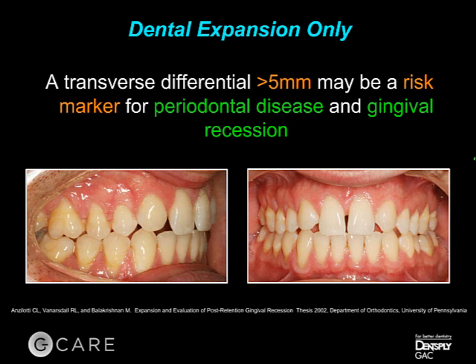When the upper jaw is too narrow and we try to get normal dental relationships on a skeletal base that is not normal, we could leave the teeth at greater risk for periodontal problems in the future, such as this case shown below, which was a 26-year-old dental student who had a history of orthodontic treatment. But you can see on the posterior teeth, there is a skeletal transverse discrepancy, and you can see that just through brackets and wires how the teeth were uprighted, but now the gingival unit was thinned, so that just with normal brushing, there was recession induced.